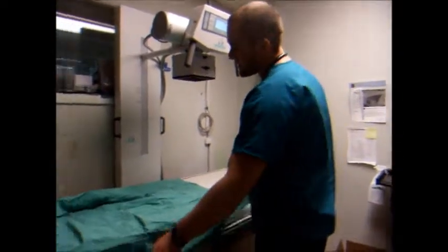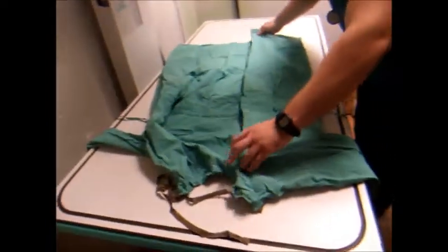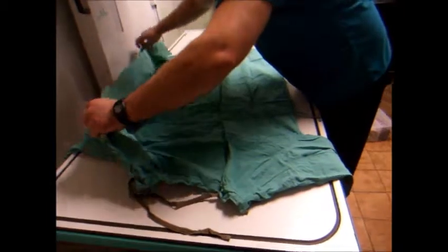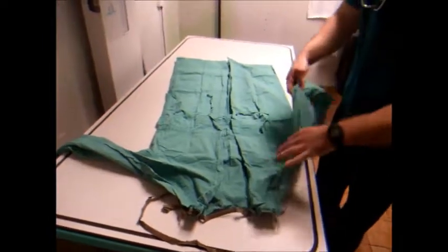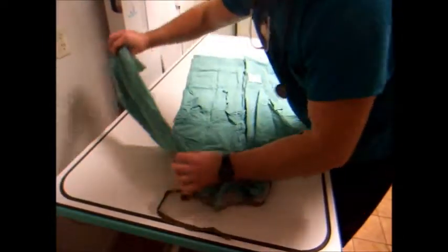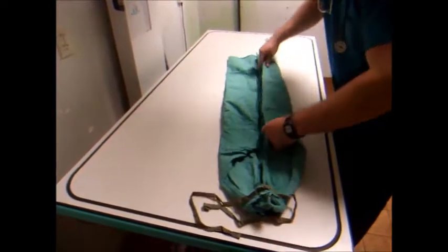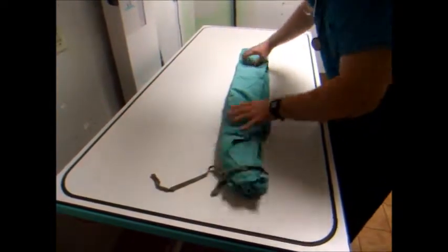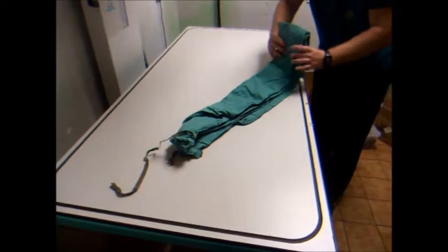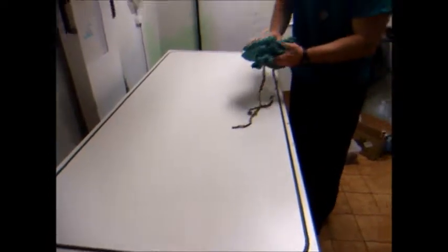Alright, I'm going to go ahead and fold up this surgery gown. I'm going to take the sides here, fold it to the middle. The arms into the middle. To the middle one more time. Reach it up. And then we got to do an accordion here. And we are all set to wrap it.